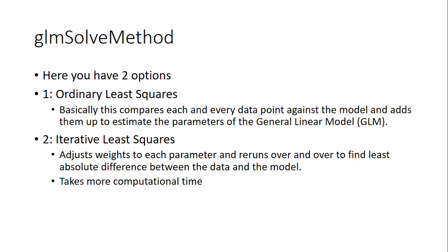It's actually suggested that if you're just visualizing the data, or you're trying to get an idea of the data, you're going to use the ordinary least squares to save on time. And if you're looking for something a little bit more beefy, or I think the most favorite word of everyone in this field, the most robust option, you'd use the iterative least squares, or number 2.